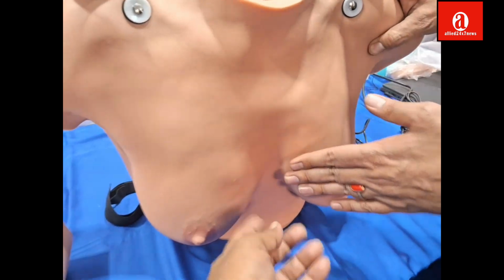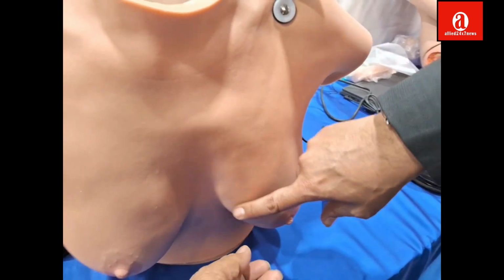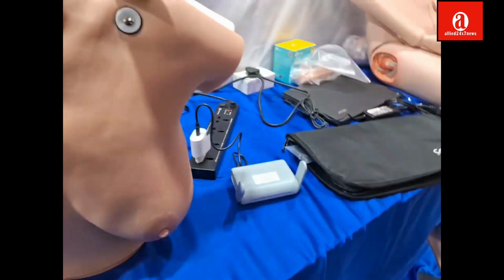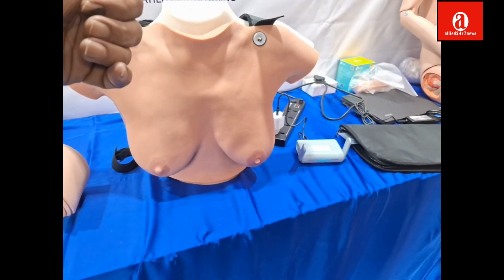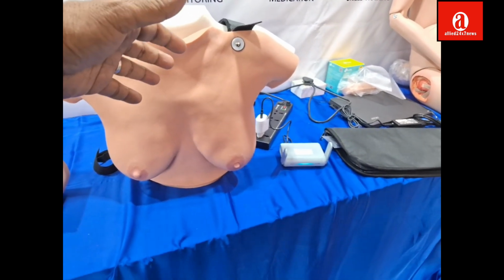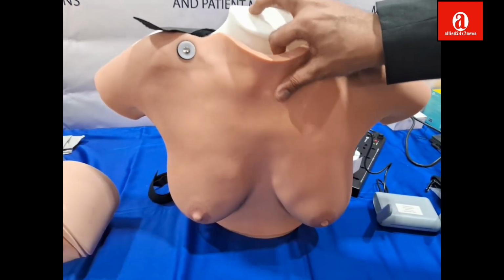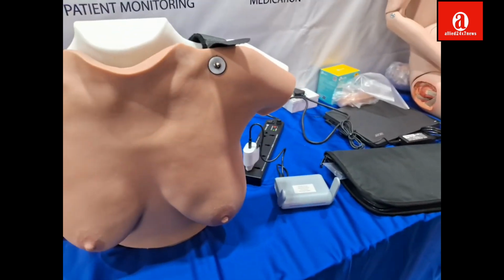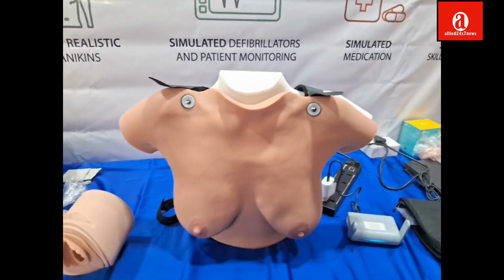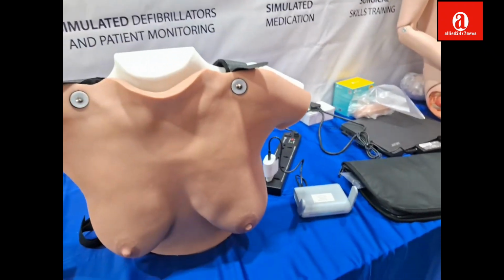Which side is that? You can see here, this is normal. There are no lumps. And this could be of different sizes? Mostly it's slim and the size doesn't matter. It's for females, but sometimes males have it, in very rare cases. Male breast surgery is for gynecomastia, where they have excess, enlarged breast tissue. Is there a similarity with that? No, that's different.